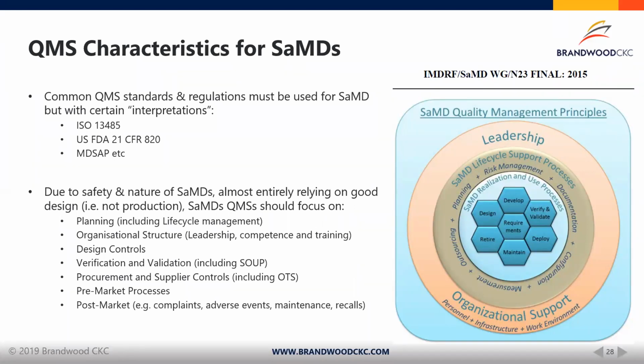Procurement and supply controls. In both outsourced processes and use of commercial off-the-shelf software, understanding, maintaining control, and managing the effect of such processes, activities, or products is important and necessary to deliver safe and effective software. This is crucial as software developers more and more rely on either outsourcing the software development or integrating off-the-shelf software products into their code.